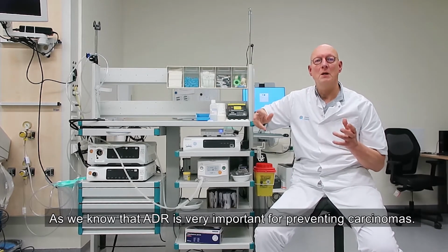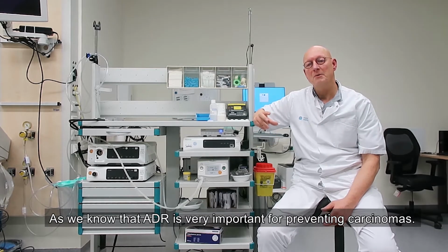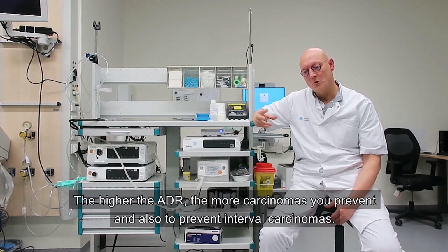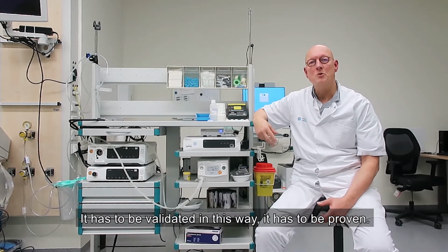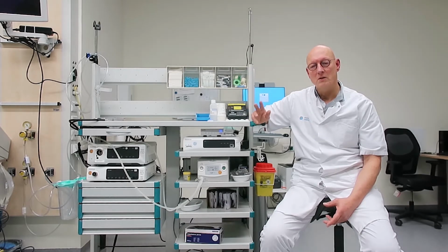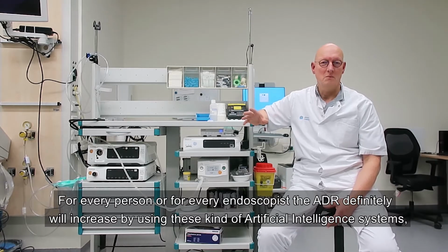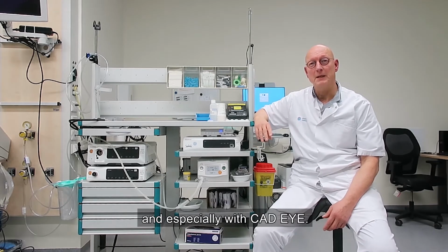As we know, ADR is very important for preventing carcinomas, and the higher the ADR, the more carcinomas you prevent, and also interval carcinomas. So it has to be validated in this way, and it has to be proven. But we know that the higher the ADR, the better the prevention of colorectal cancer is. And for every endoscopist, the ADR definitely will increase by using these kinds of AI systems, and especially CAD EYE.